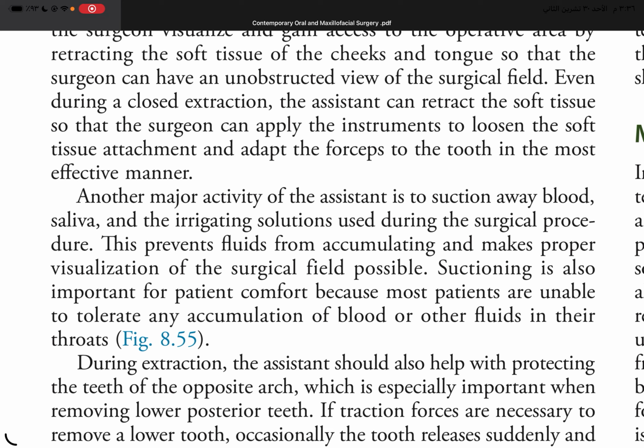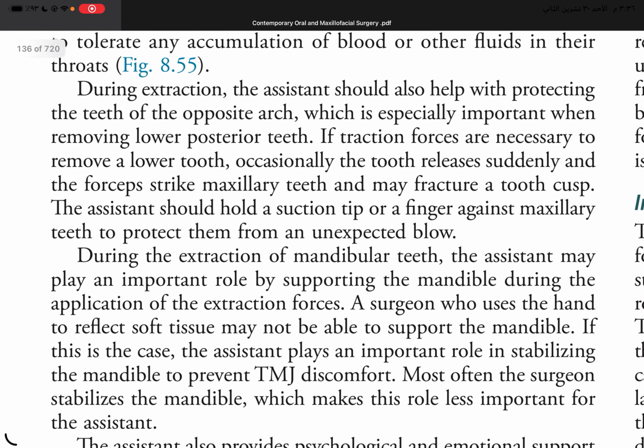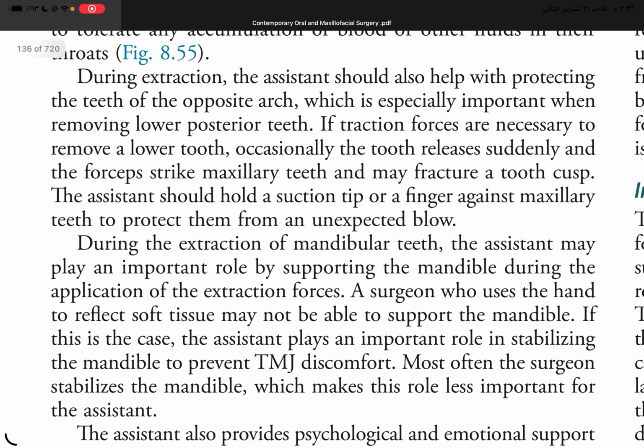During extraction, the assistant should also help with protecting the teeth of the opposite arch, which is especially important when removing lower posterior teeth. If traction forces are necessary to remove a lower tooth, occasionally the tooth releases suddenly and the forceps strike maxillary teeth and may fracture a tooth cusp. The assistant should hold a suction tip or a finger against maxillary teeth to protect them from an unexpected blow.